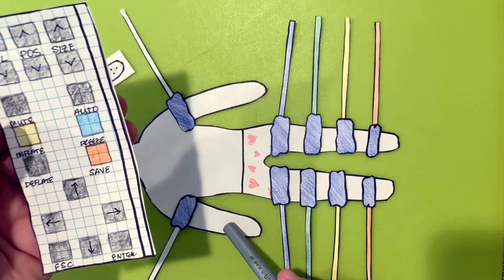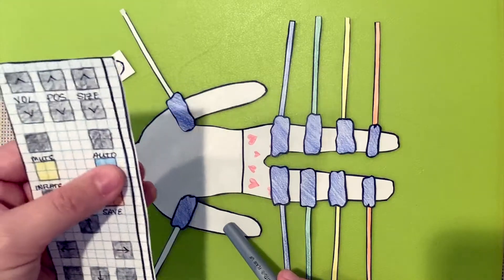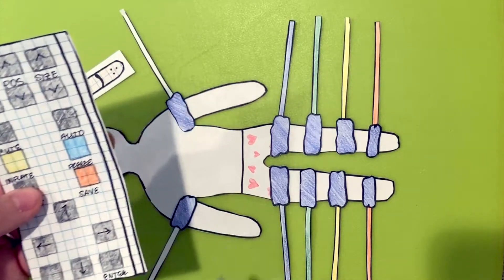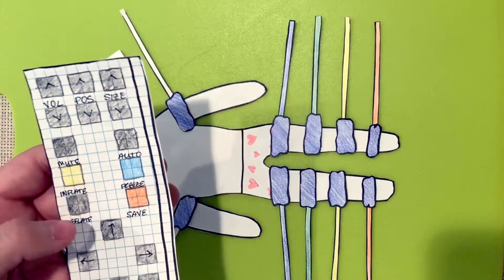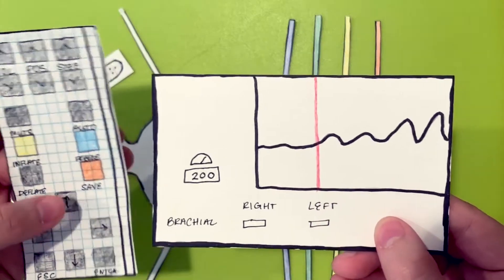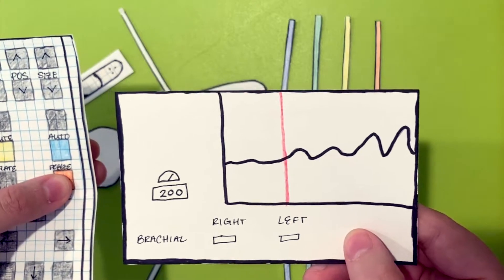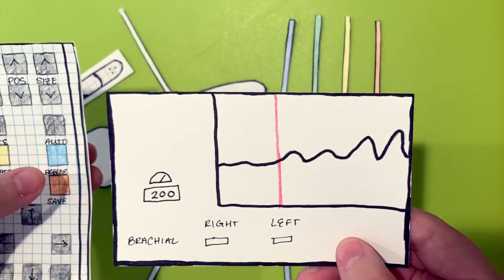The cuff will bleed back on its own. When the signal returns, freeze the frame and quickly deflate the cuff. You will then scroll back to the first pulse and acquire the pressure with the save button on the remote. This reading is the systolic pressure.